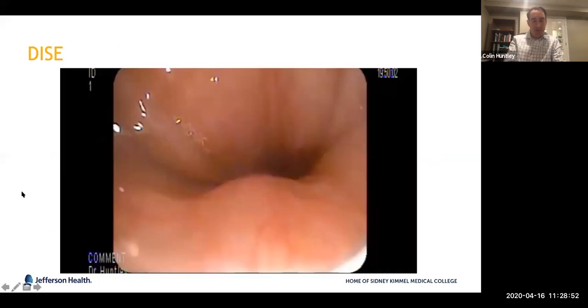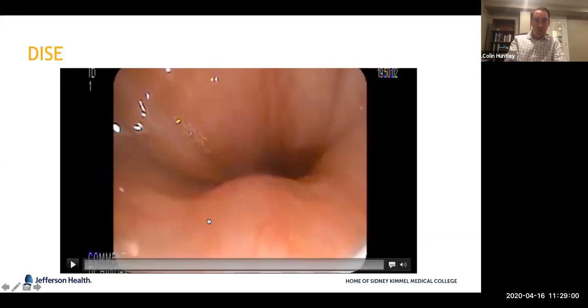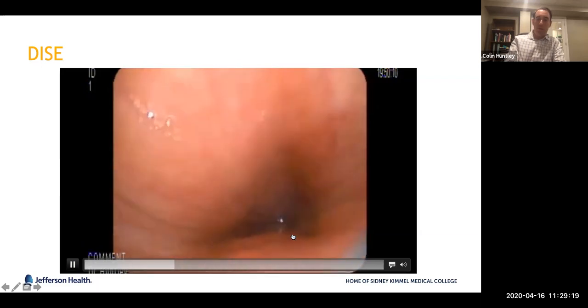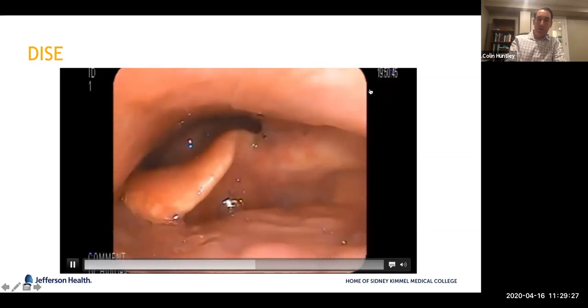So this is a video of a sleep endoscopy of someone with that concentric collapse of the palate and lateral oropharyngeal obstruction. I'll just orient before we get started. So this is the palate. We're in the back of the nose. This is the soft palate. This is the posterior wall of the nasopharynx. And you have your eustachian tubes over here, and they're going to be out of view. But as we're looking down, you see a long vertical palate that has this concentric or almost funnel shape to it. And as we get down, you can see lots of obstruction or collapse of the lateral walls.